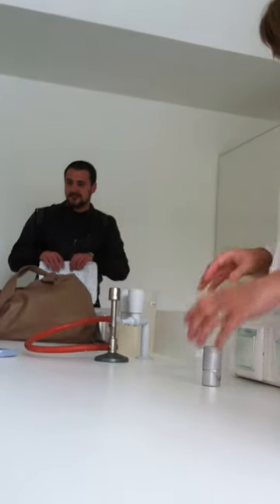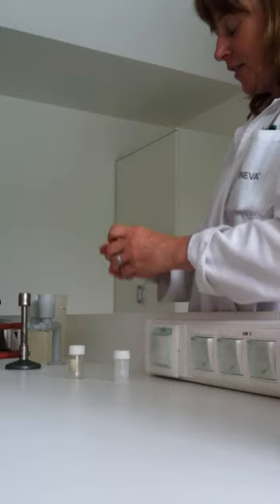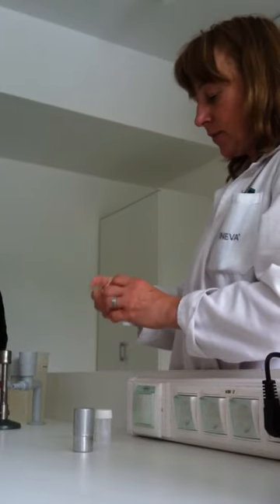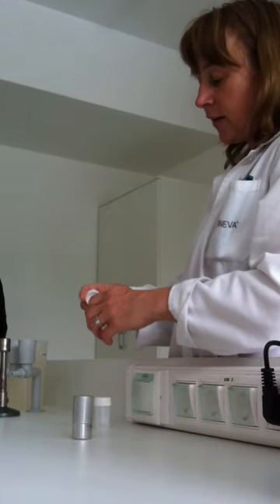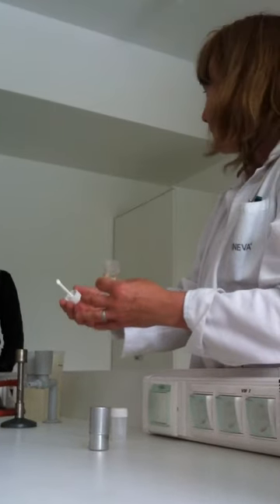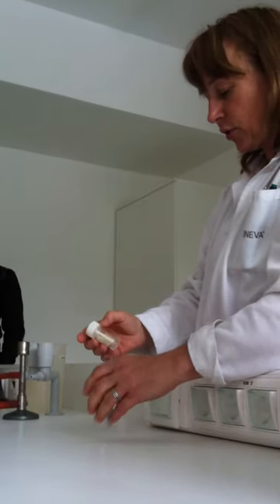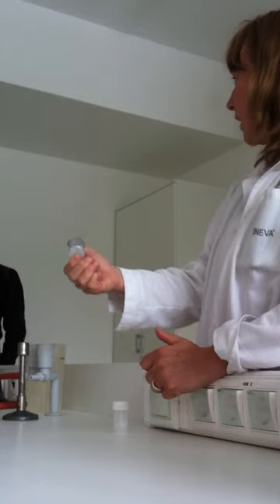Yes. Okay, so the feces. The container sometimes is better because there is a protective layer, because sometimes the sample overfills and the outside has been contaminated. Usually we don't like this. So there is feces, you can imagine, mucoid, bloody, so from the suspected area, one spoon is enough. You can put it into the container, and then if there is a second container, you can transfer it.